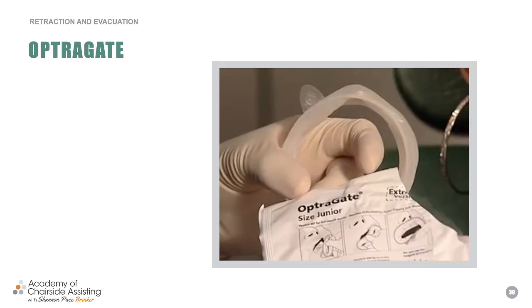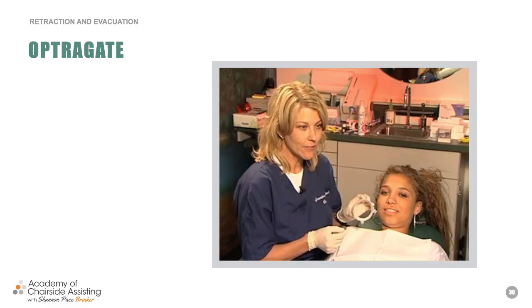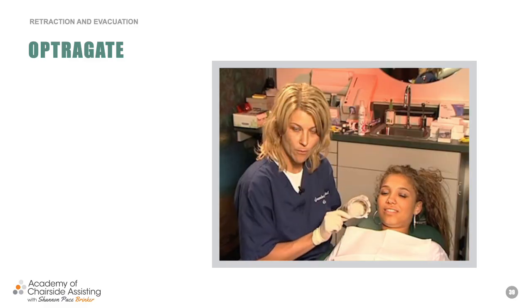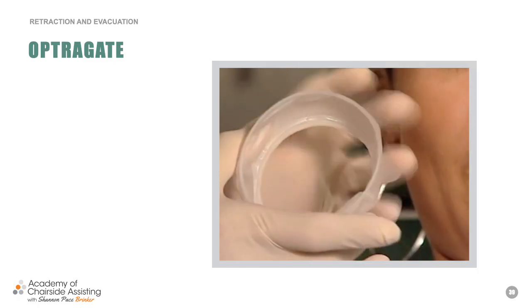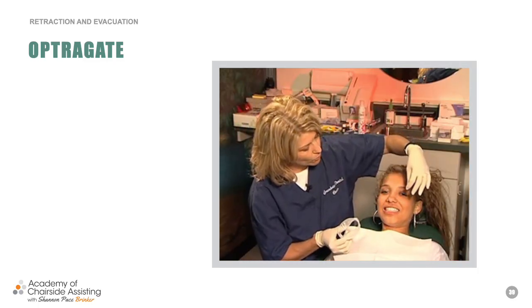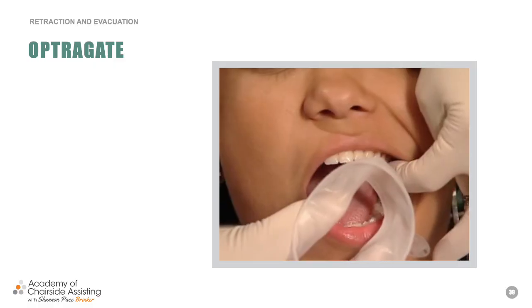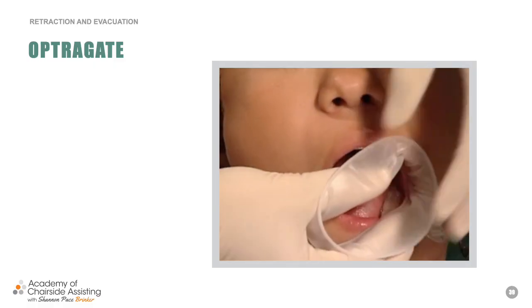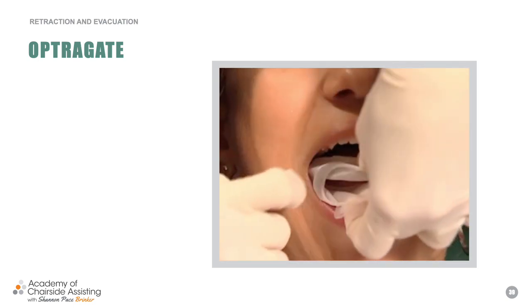This is from Ivoclar Vivadent, and this happens to be my daughter Haley. You may be wondering, why didn't I put glasses on her? Well, we were just doing a demonstration for you. When you open this up, you'll see here exactly how to place it. Just slip this in, and basically just relax. Just going to slip in like that. And we're going to slip this side in. And it's going to kind of go up.